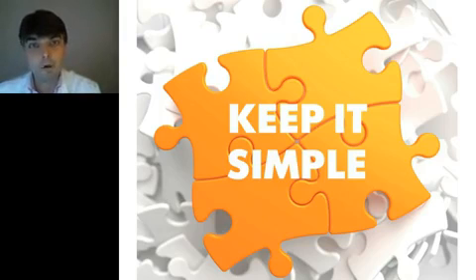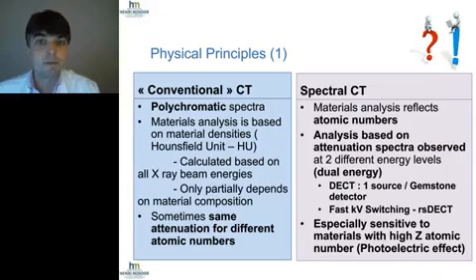So on we go. Let's discuss the difference in physical principles between a conventional CT system versus a spectral CT system. With the conventional CT system, we are dealing with polychromatic spectra of energy. That is, the X-ray beam has different energy levels, up to 120 kVp, which is the peak of the energy of the photons.